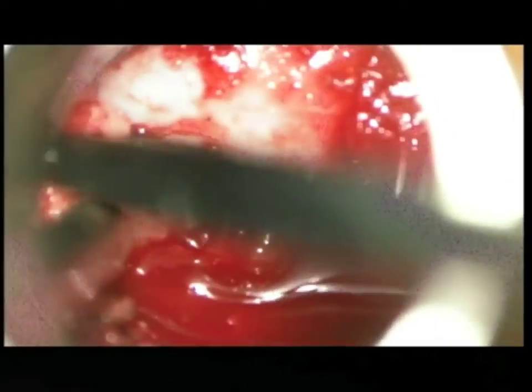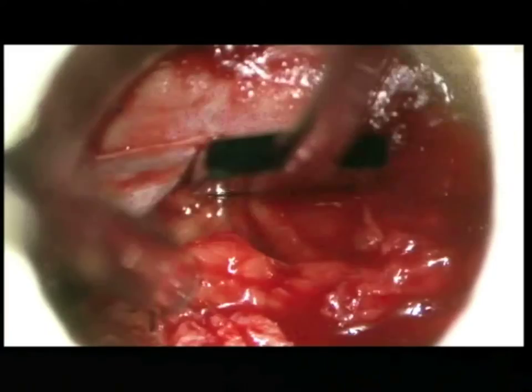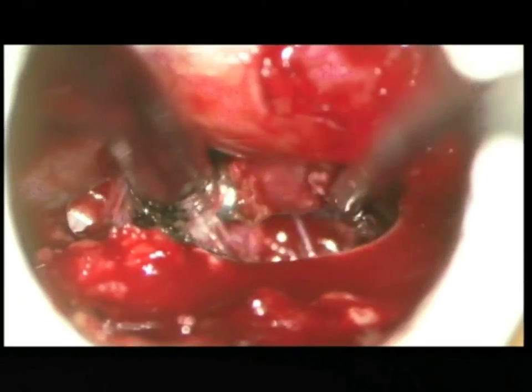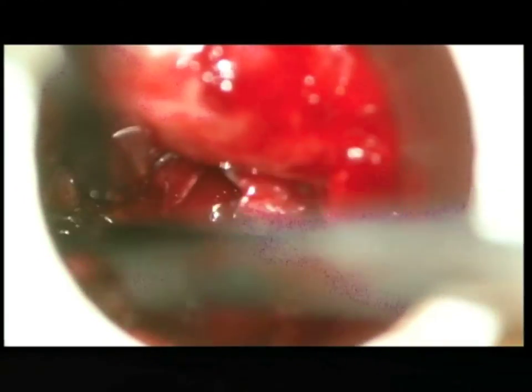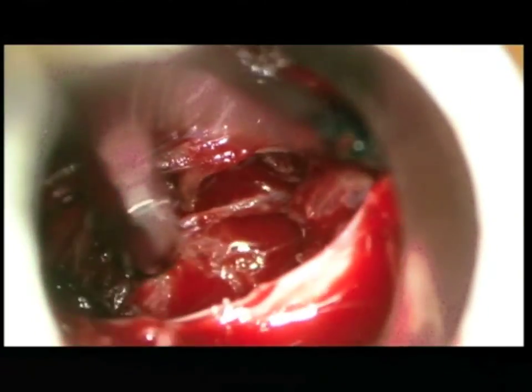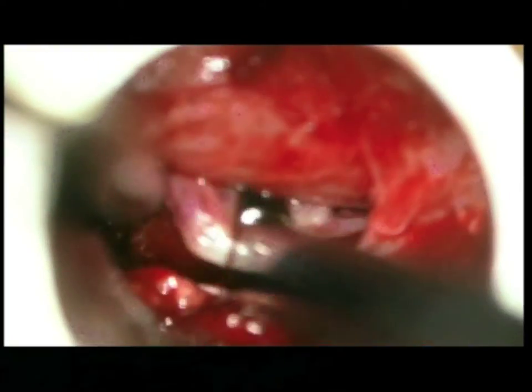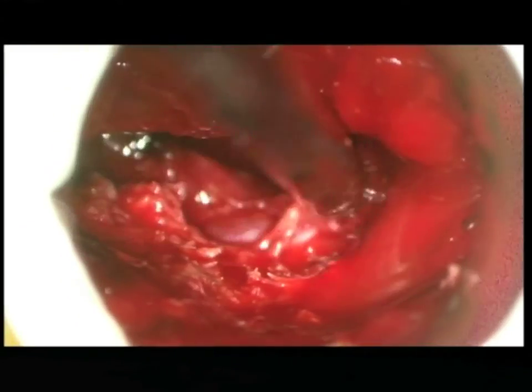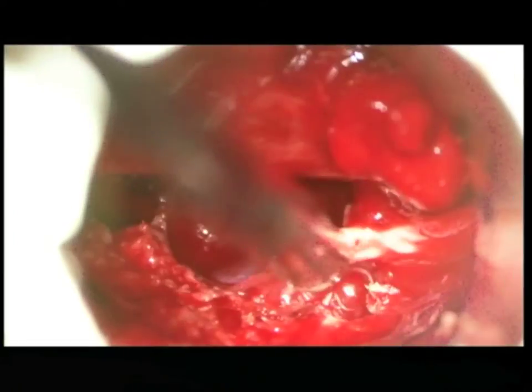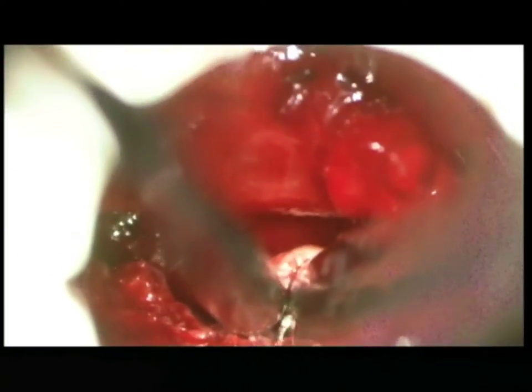Resection of the dorsal epidural tumor is performed with a ball tip probe and Kerrison rongeur. The thecal sac is retracted medially and protected to expose the ventral tumor. Ventral tumor is dissected with a ball tip probe, pulled into the field, and resected with Kerrison rongeur. The exiting nerve root is identified and decompressed with tumor resection and widening of the foramen.